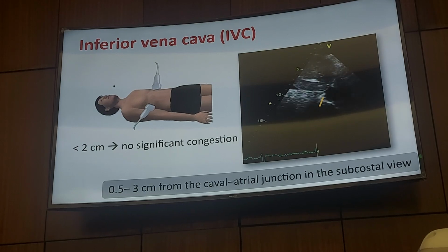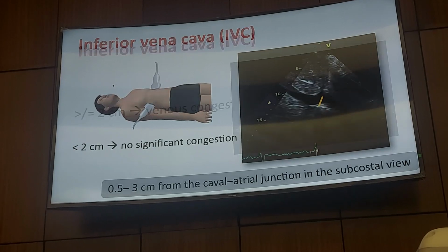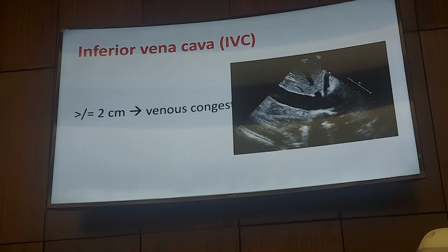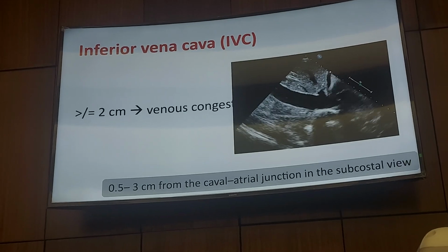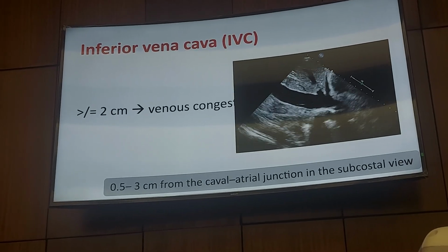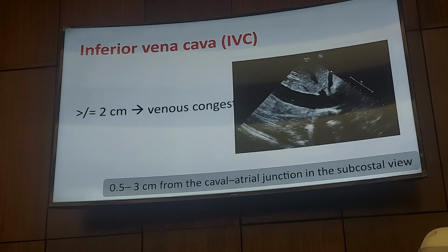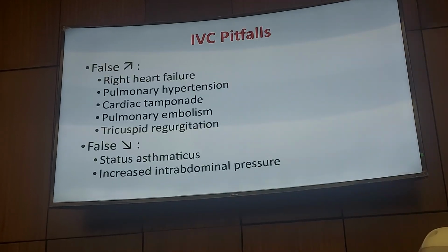If you see asymmetry in the IVC circumference, you take the average of both the longest and the shortest diameter. And that's how the dilated IVC looks. And also we observed that patients with high systemic venous pressures have dilated hepatic veins, even visually, before measuring the hepatic venous flow by color Doppler and pulsed wave Doppler.